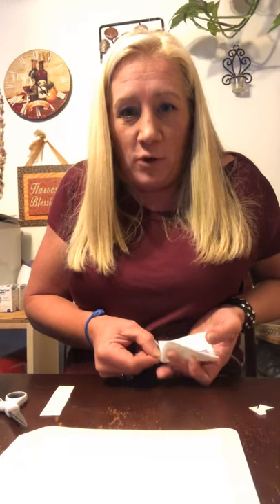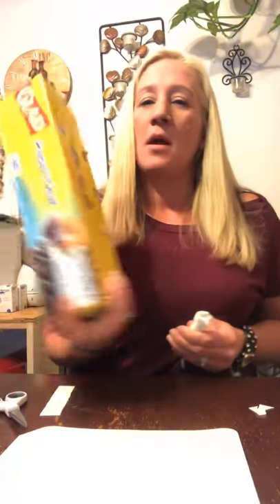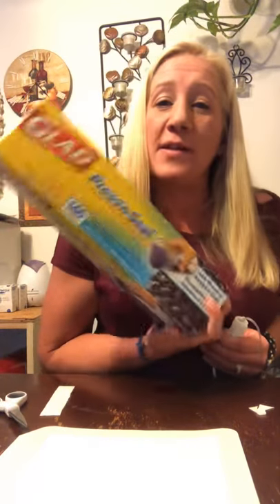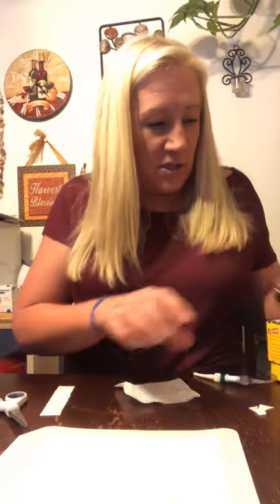So here's your connector. You're going to take it, fold it, wrap it, tuck it, and fold it up just like that. That's what Press'n Seal is for. I find that this works better because it's not sticky and it comes off really easily.